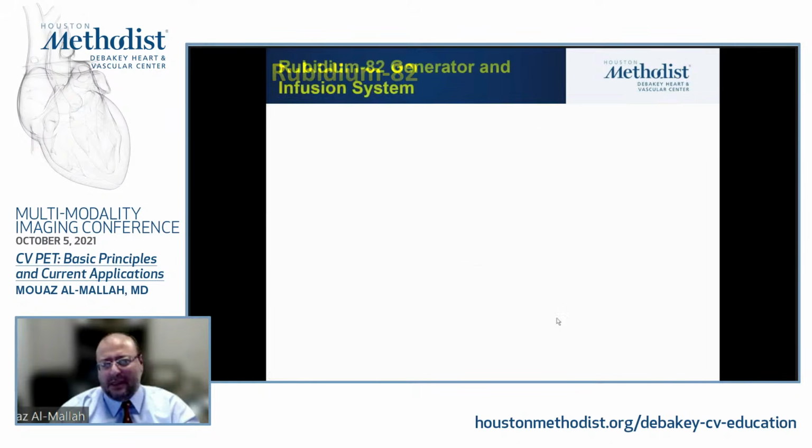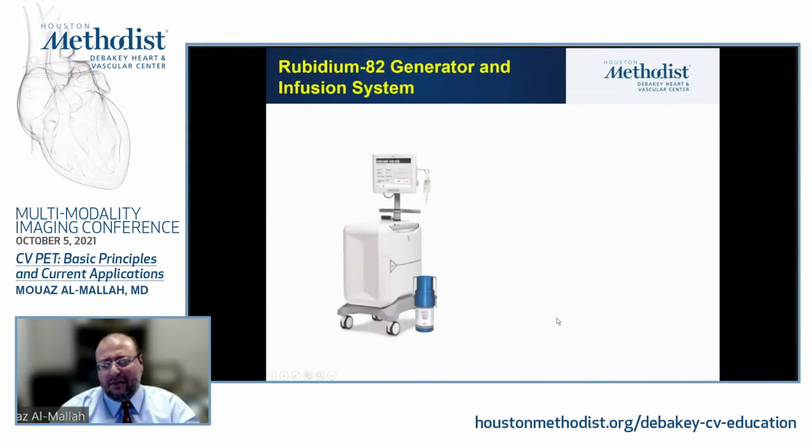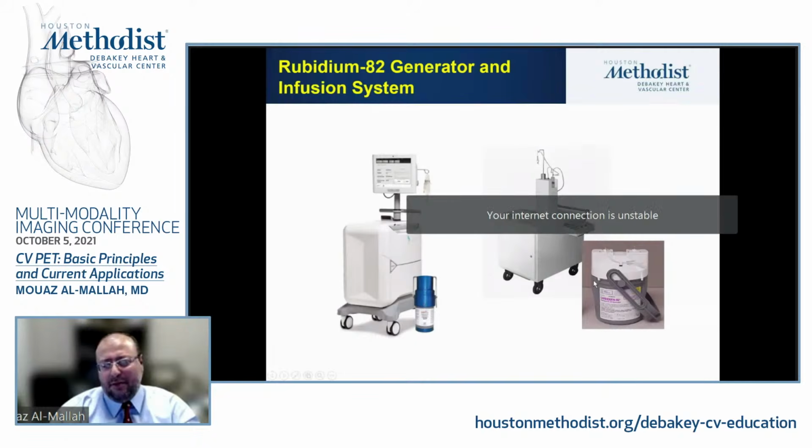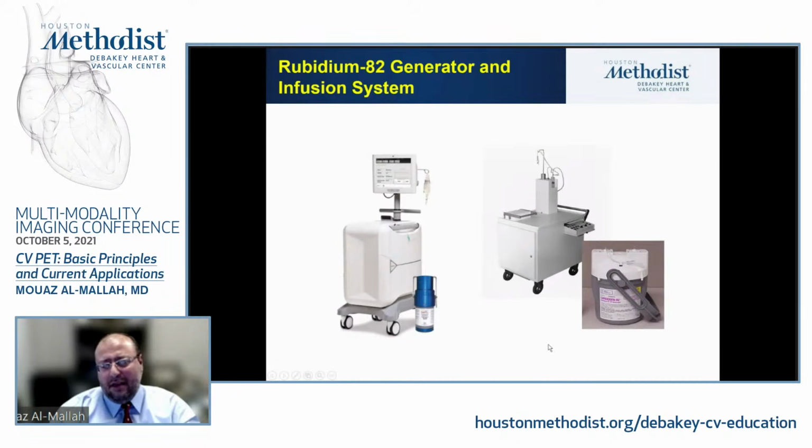Now we have two vendors who have rubidium 82 generators. This vendor, Bracco, actually has a newer injection system, and the other is coming from GDI and Jubilant, and both of them are able to give you rubidium, and you can perform your study. The ease of using rubidium is that you have rubidium on your site.